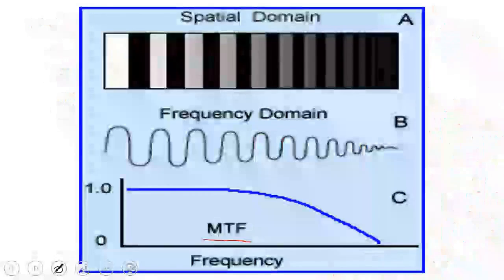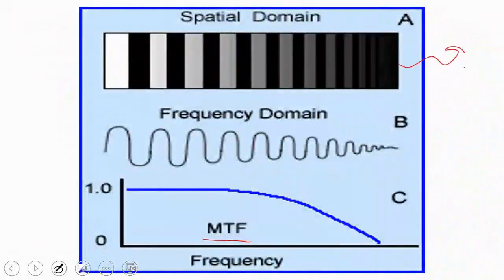So here is the same idea. The line pairs I have, the distances here were large, then they decreased and became very small, so your frequency increases. But take note, when the frequencies were here, a little in this area or in this area, I was able to achieve high contrast. I was able to see better and clarify better, okay?